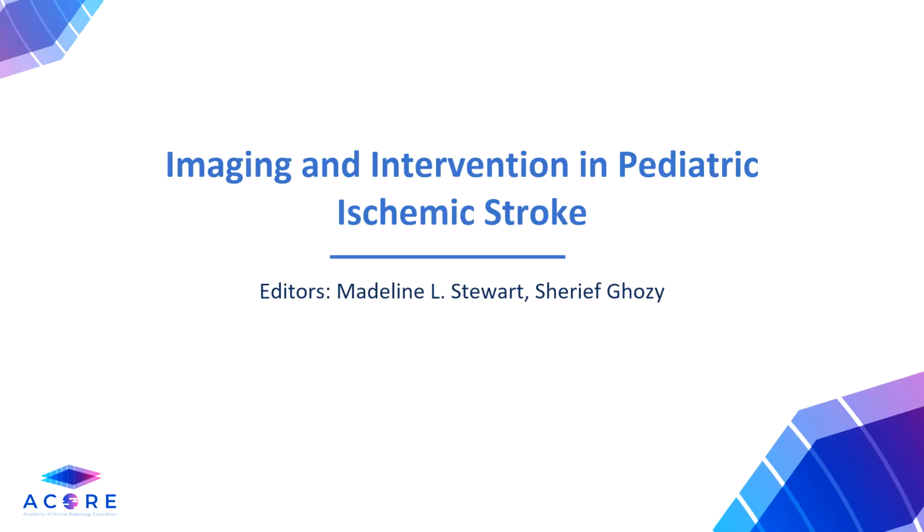My presentation and blog based off of this narrative review are entitled Imaging and Intervention in Pediatric Ischemic Stroke. This narrative review synthesized current literature on pediatric arterial ischemic stroke with an emphasis on early recognition, streamlined imaging protocols, and a coordinated emergency management pathway.